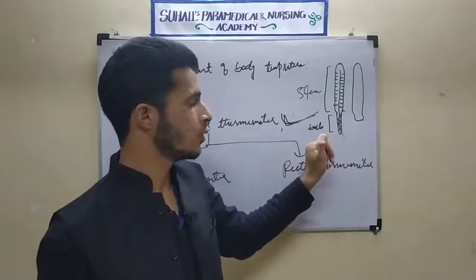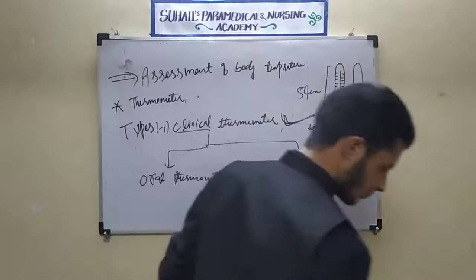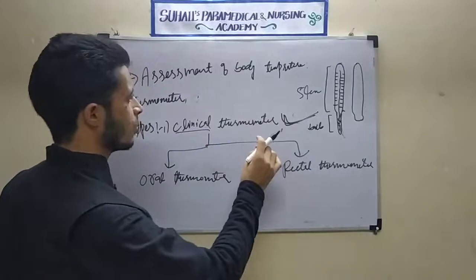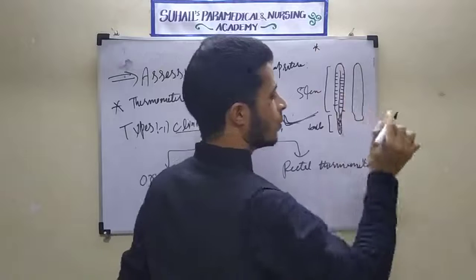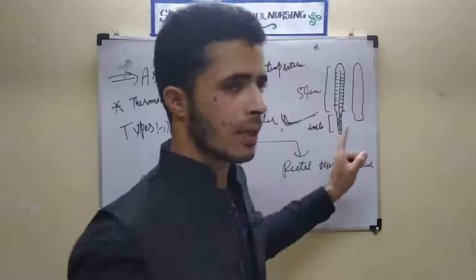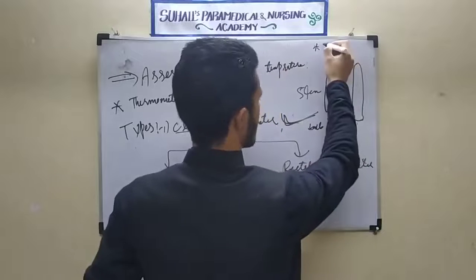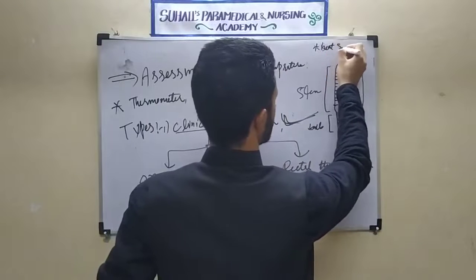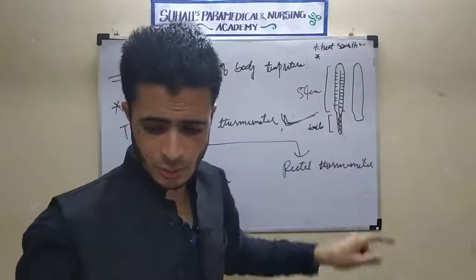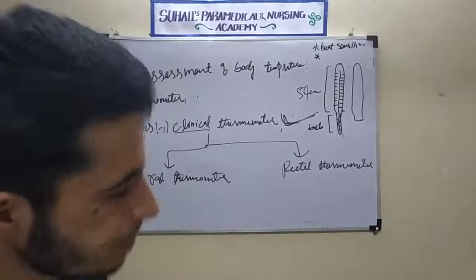Why is mercury used? I am giving the reasons. First, I told that mercury is a liquid metal.